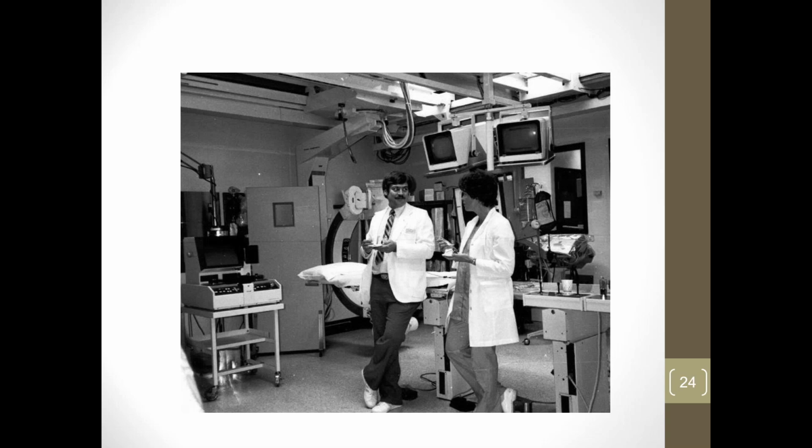So this one's a cath lab from the 1970s, late 70s. And unfortunately for the cardiologists, the monitors hadn't gotten much bigger or any better. Over here, when I was talking about the cine film camera, you can see the camera right there on the side of the II. And this is where the cardiologist would sit and read the film.